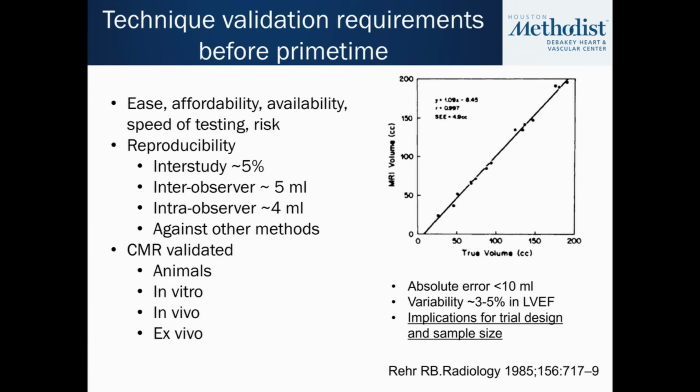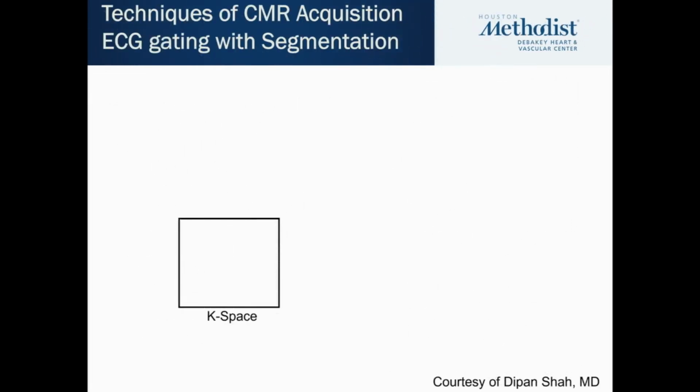CMR might be one of the best ways to include patients in your study and track them over time, because if the heart is remodeling to a small extent, or if you want to determine a threshold for remodeling of whatever number, CMR is going to be the best way to show a change or the lack of a change, obviously. And this changes the number needed to incorporate into your power analyses for studies.